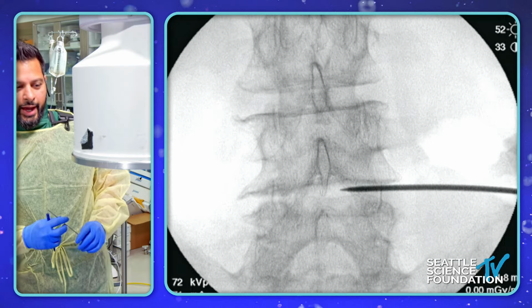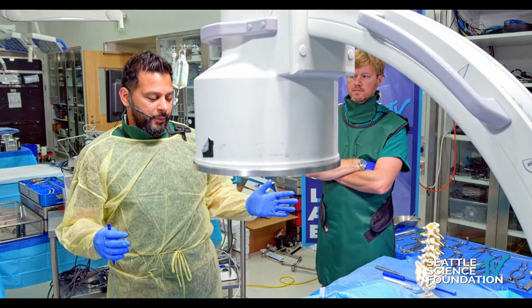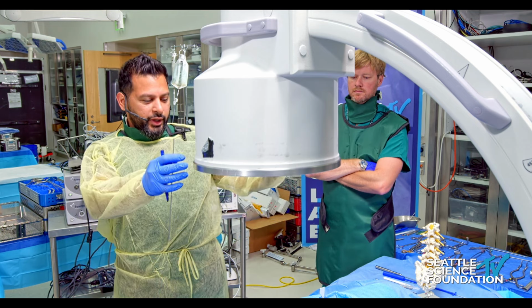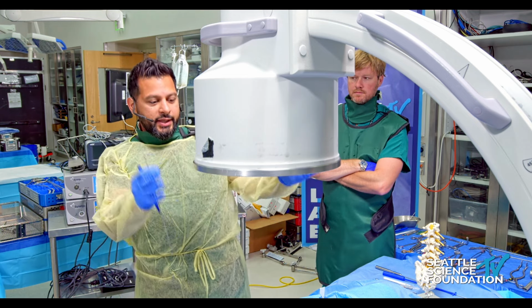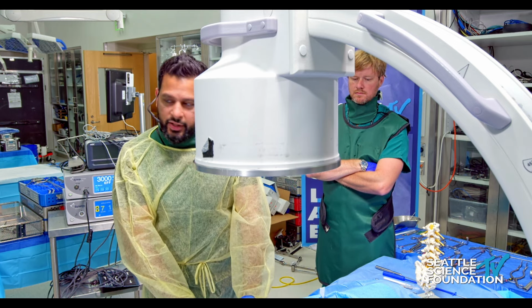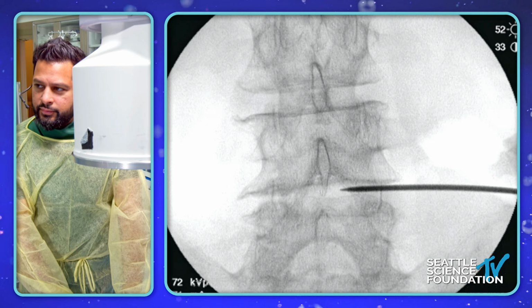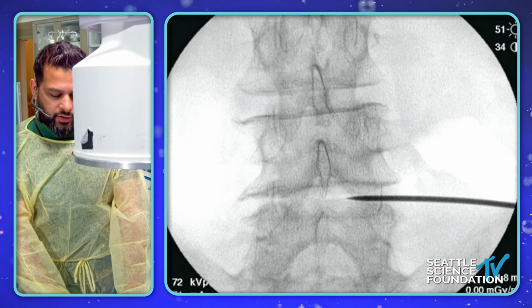The big thing I like to focus on when I'm doing this is, for the orthopods here, when we're putting freehand screws in for different parts of orthopedics, we become the beam. So you see the beam right here is, if I use an angle right here, take a shot there. Right there again, shot. Sorry, right here, shot.